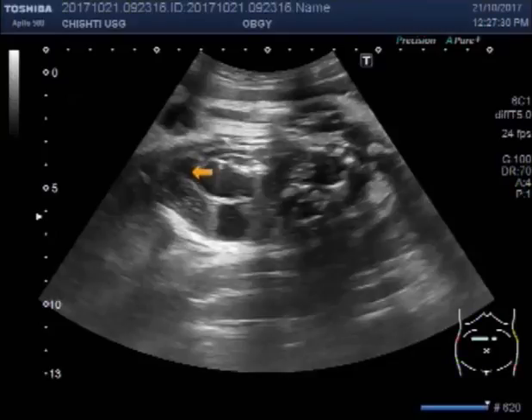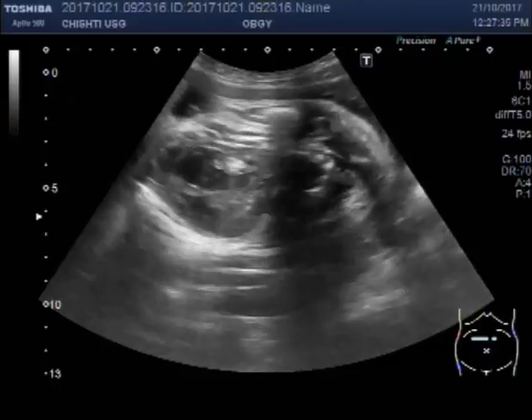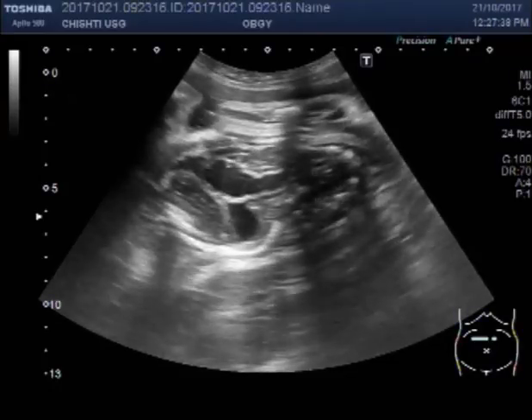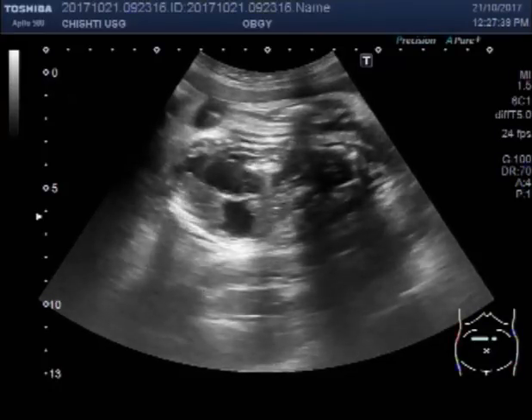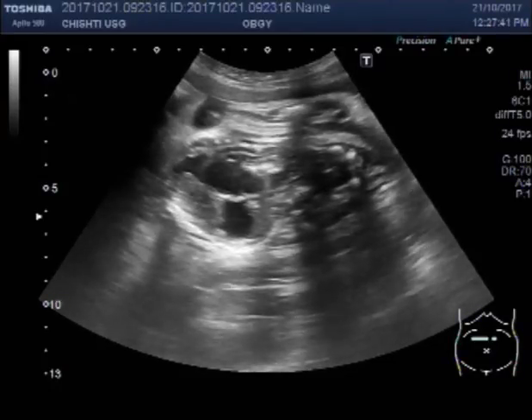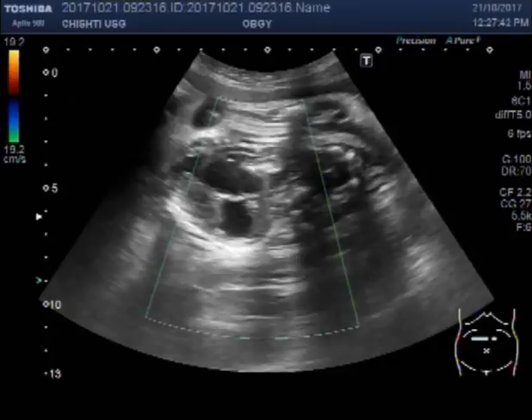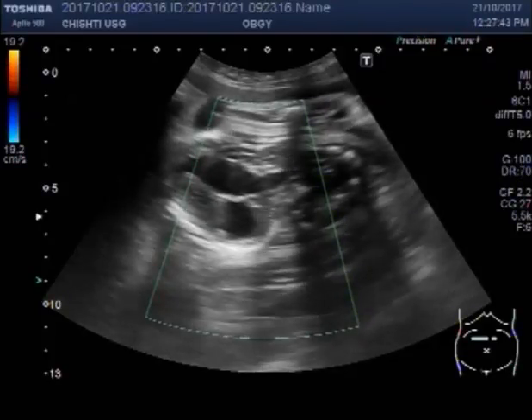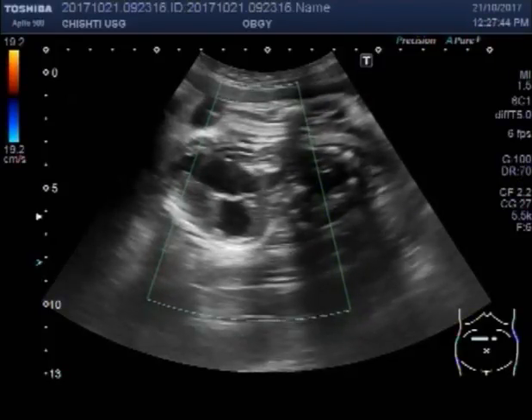Now you can see the fetal heart. There is no cardiac activity — silent heart. No blood flow is seen in the fetal heart.